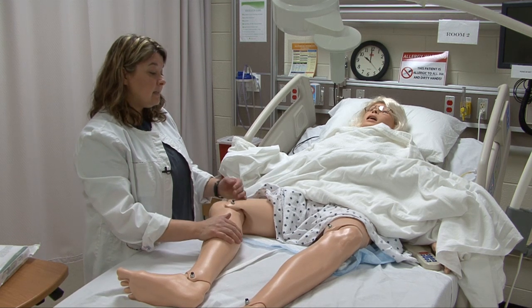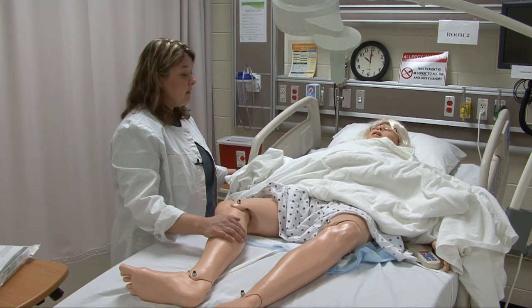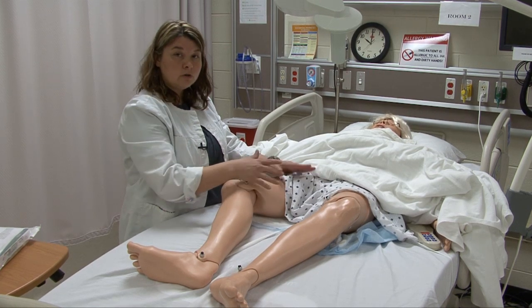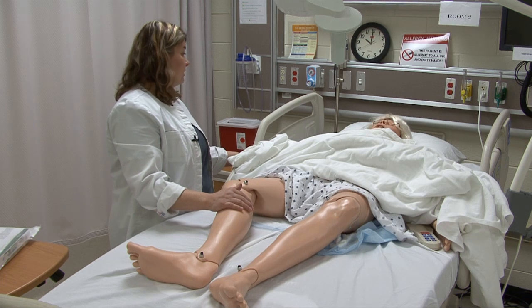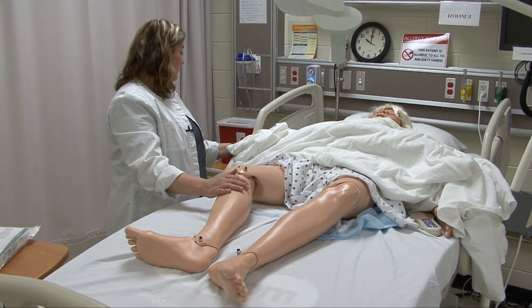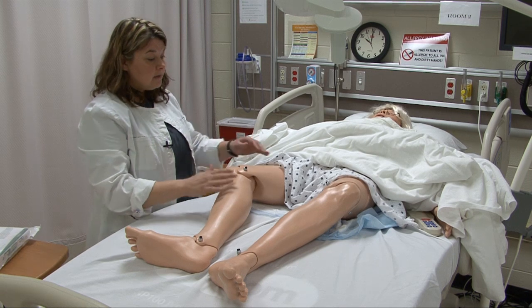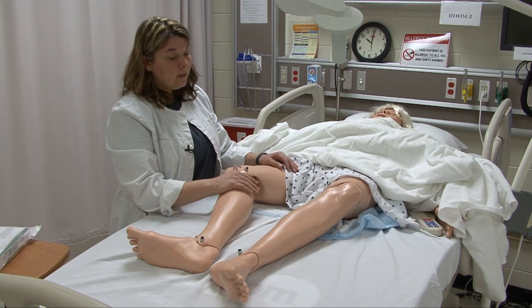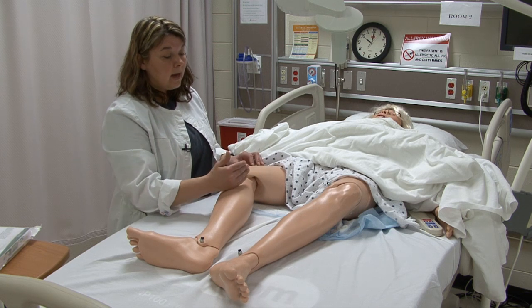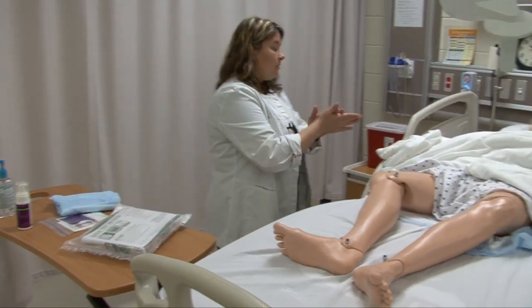I'm going to explain to her that I'm going to lay her head down, Mrs. Smith. With ladies, this is important because if her head is up, it's putting pressure down on her perineal area and will actually cause the structures to be occluded — you won't be able to see as well. I usually lay the patient's head as flat as possible if they can tolerate it. You could also put your patient in a mild Trendelenburg with her head down just a smidge to take pressure off this area. I'm going to foam my hands again and put my gloves on.